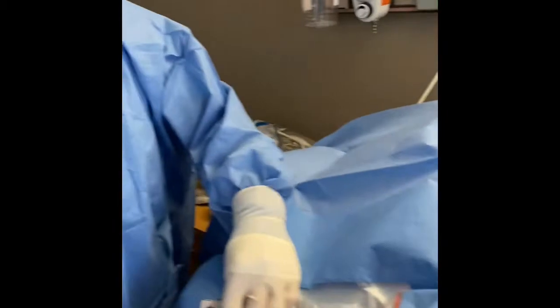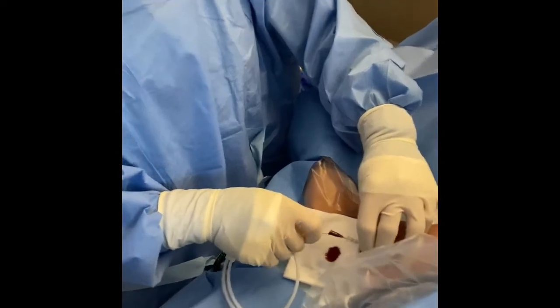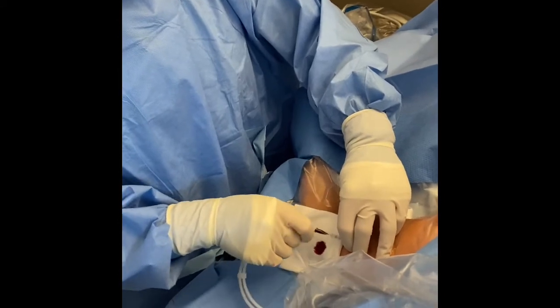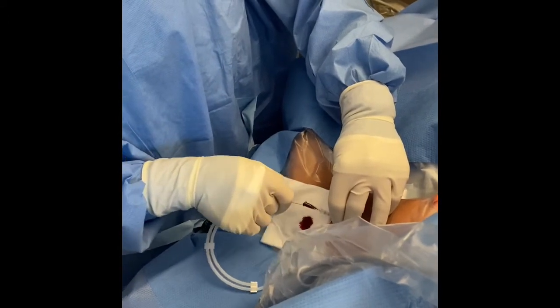Now we will be putting the guidewire on the needle. Is it threading smoothly? Yes. Good — that is an indication that you are already in the vein.